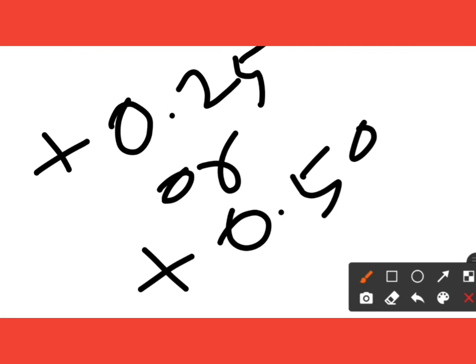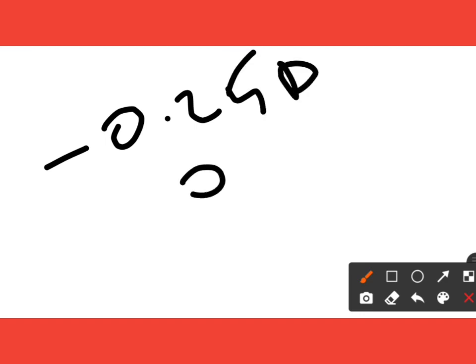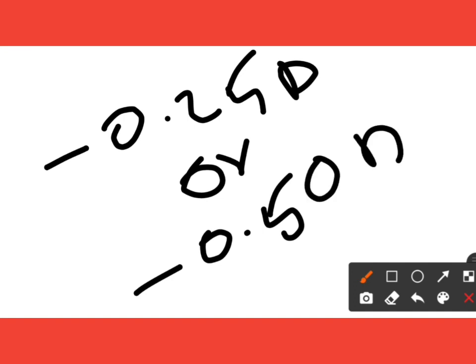In these steps you put the power until the patient says both colors appear equally clear. If the patient says red is clearer than green, then you put minus 0.25 diopter or minus 0.50 diopter steps of spherical power until the patient says both background colors are equally clear.